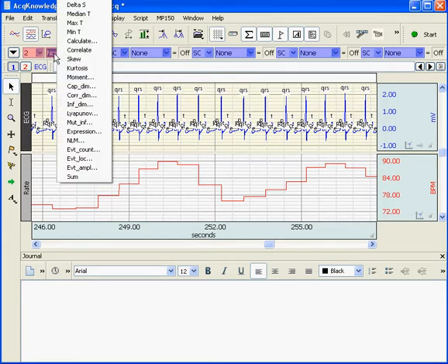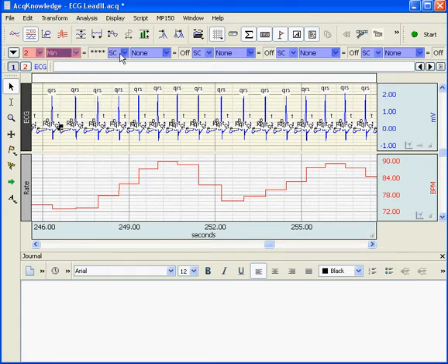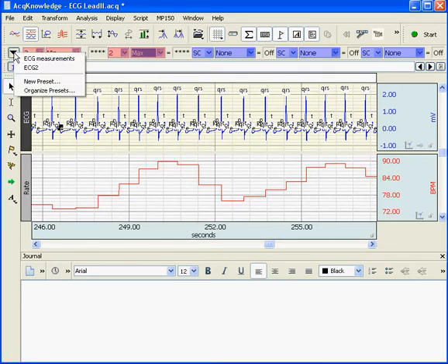If I pull down my measurement, I can select min, max, etc. Or, in version 4.2, we now have these new measurement preset boxes.